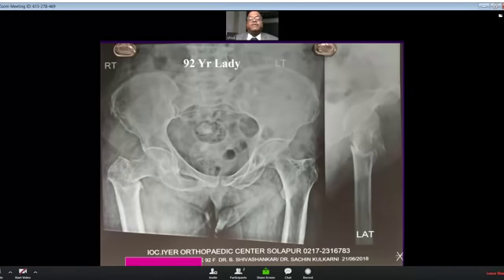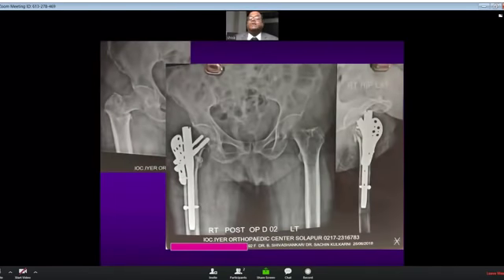So because of severe osteoporosis, I used this Dr. Shivashankar Benjale's trochanteric buttress plate, and I have compressed the fracture site beautifully against this plate. If I had not used this plate, I would have compressed definitely against the nail. But because of severe osteoporosis, I thought it's prudent to use this plate in this case. So this is an option you have got.